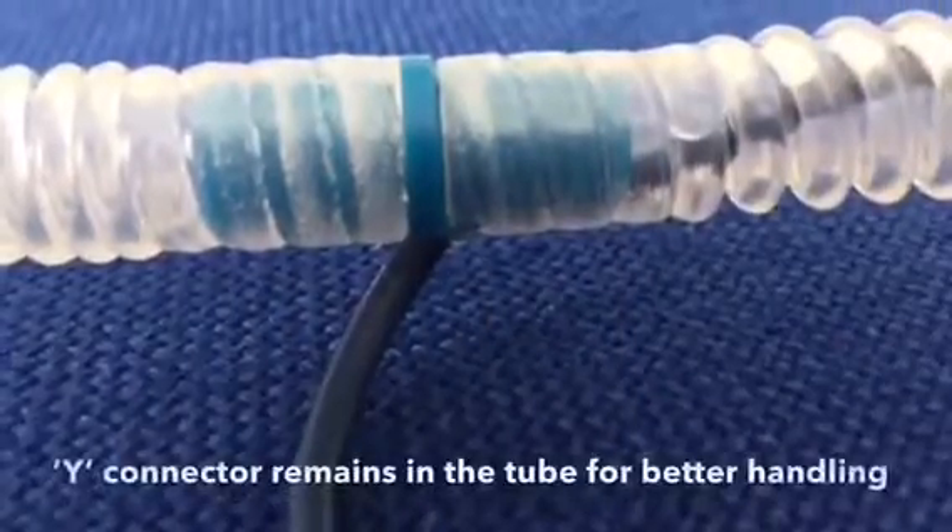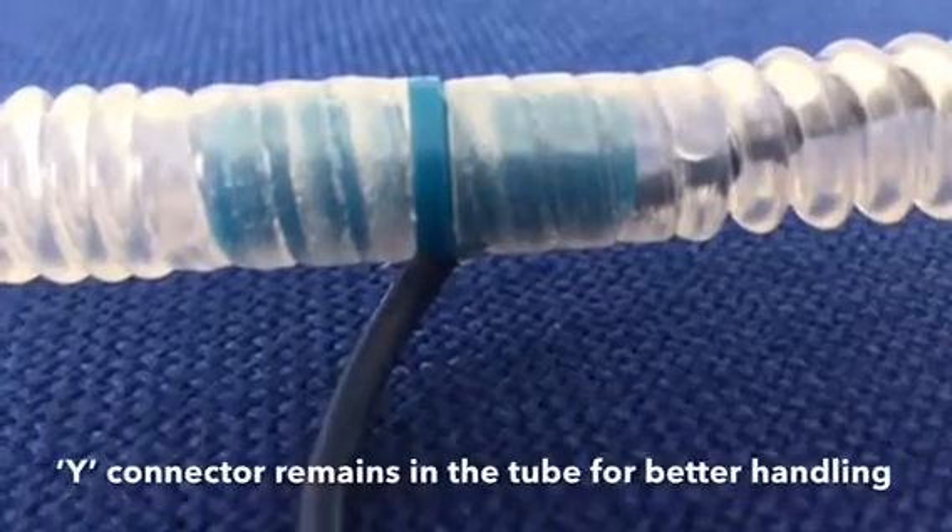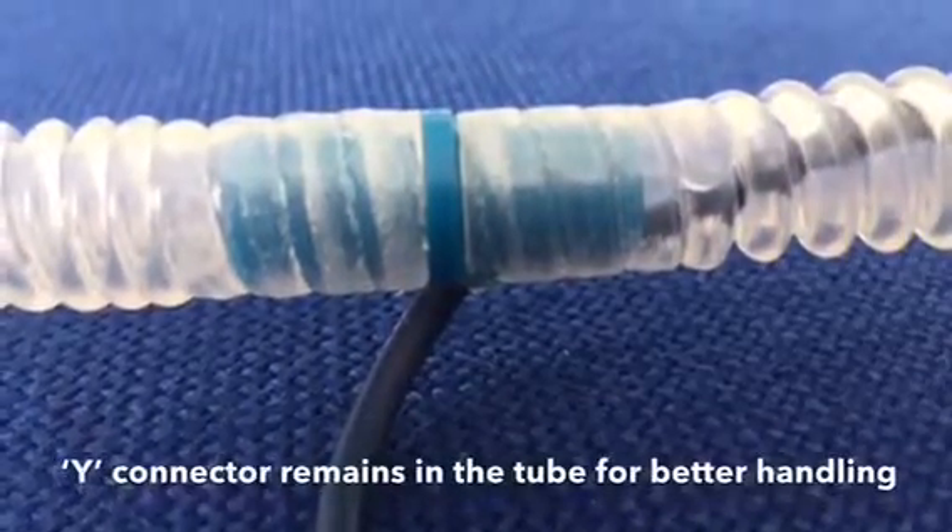The Y connector allows the cable to stay inside the aspiration tube for better handling of the pencil during the intervention.